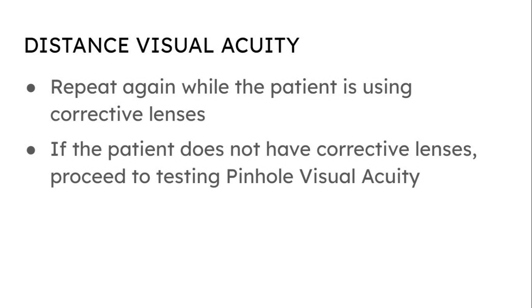Repeat again while the patient is using corrective lenses. If the patient does not have corrective lenses, proceed to testing pinhole visual acuity.